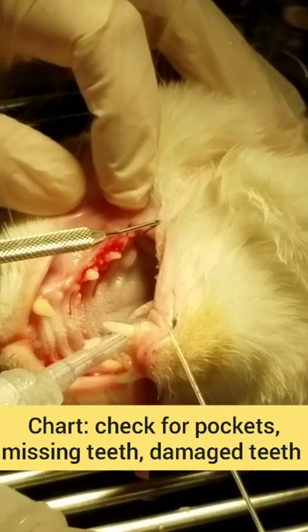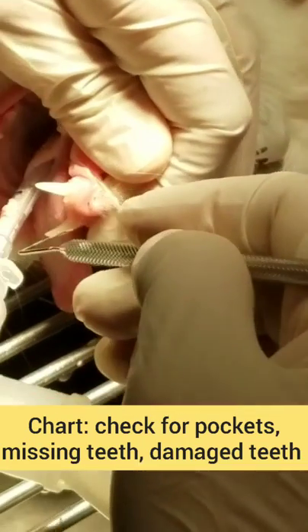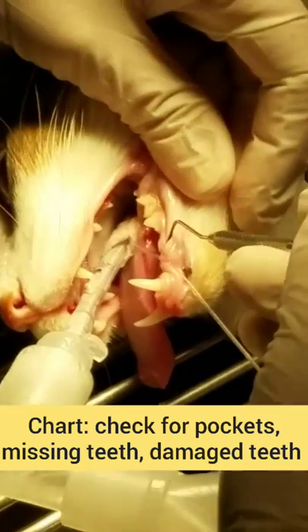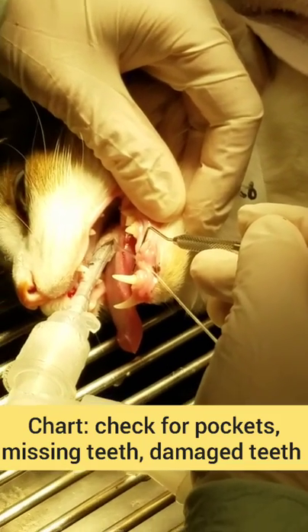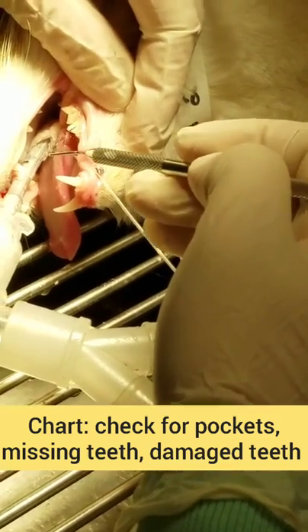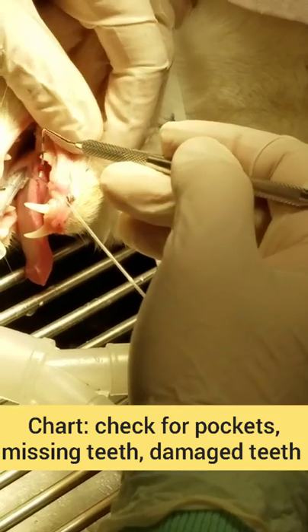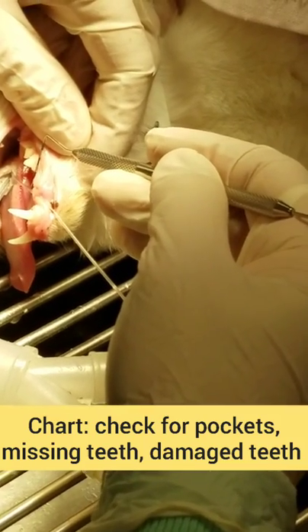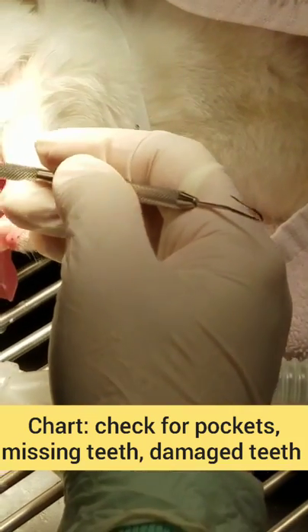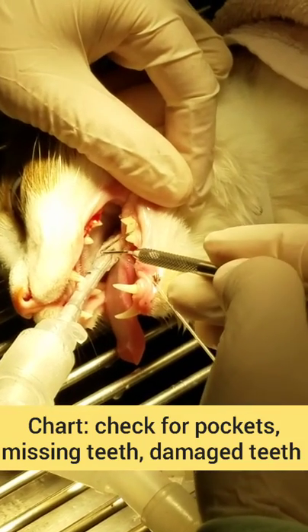That one looks a little loose. There should just be 3 of them. So, 6 and 7-8-9 on the bottom. That one's resorbed. We always start on the other side, so this is 2 and 3. We have 7 resorbed, tooth 3-0-7, and then 2-0-6. And everything else looks pretty great.